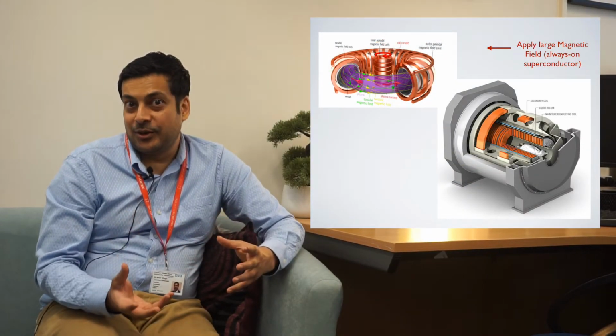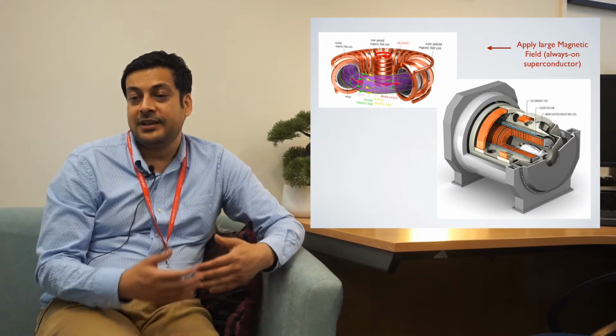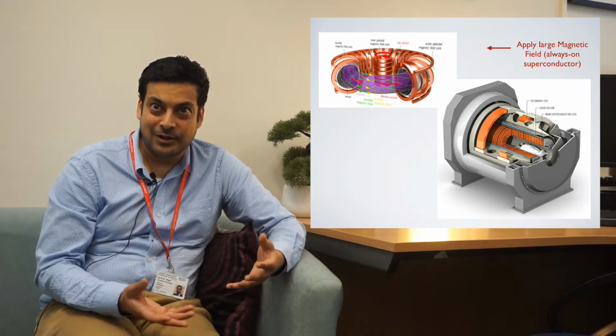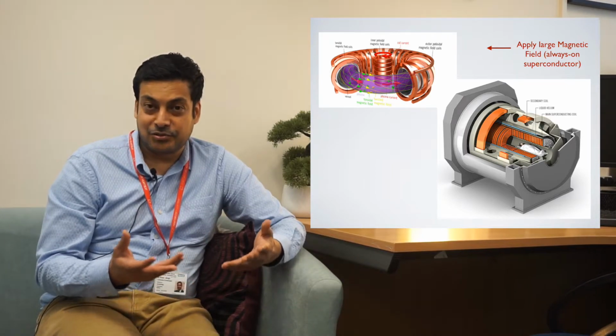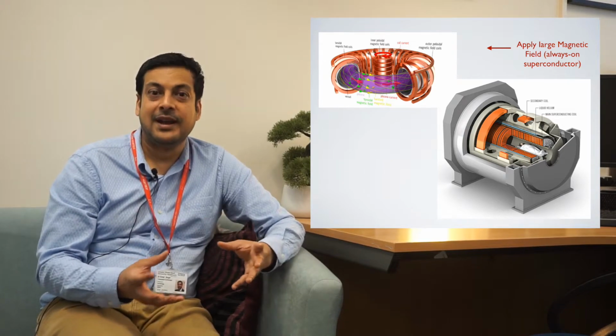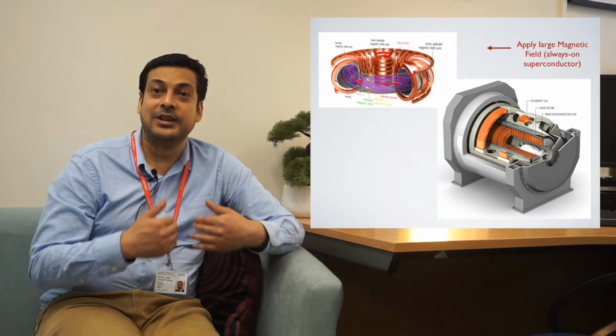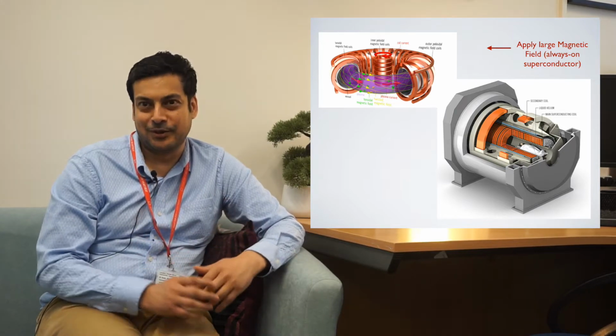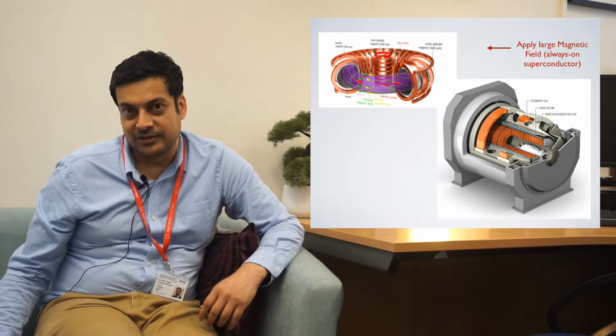That magnet is always on. The way in which you generate it requires the superconductor to carry on going round and round, so that entire structure is continuously going round and round. And that means the magnet is always on, whether we're using it or not. It's a continuously very powerful always-on magnet, which is one of the safety considerations with MRI.